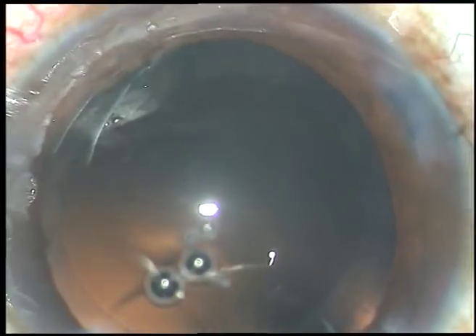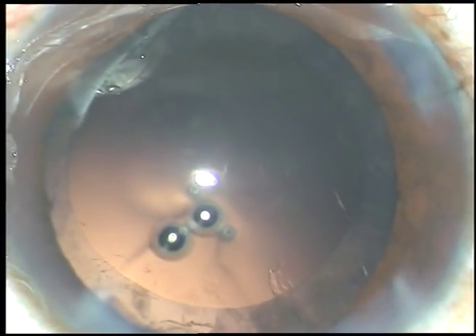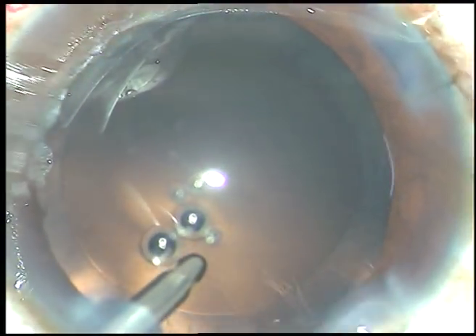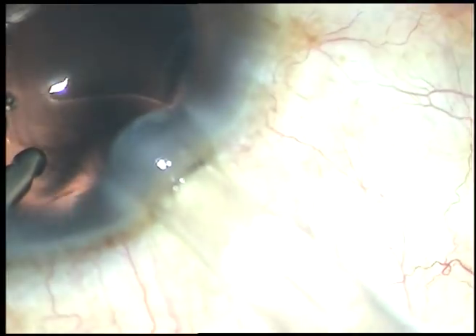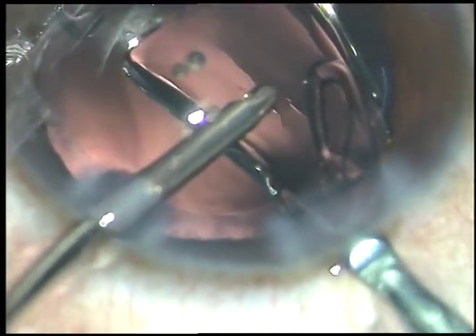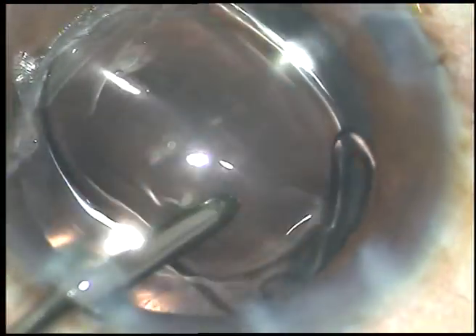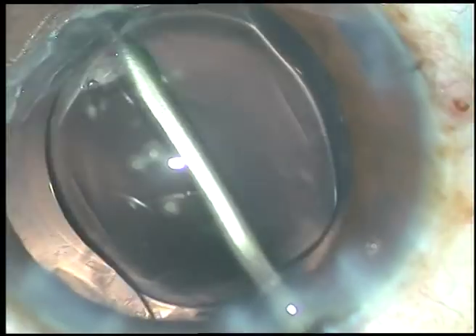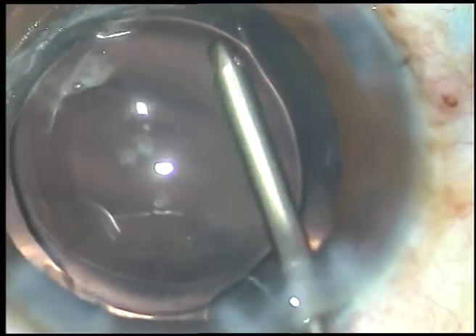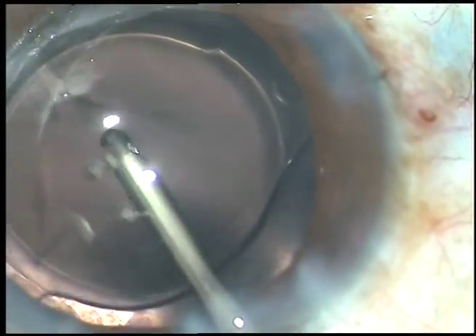In this case, we have selected a hydrophilic acrylic intraocular lens, and it is being implanted keeping the anterior chamber formed under irrigation. The irrigating probe supports the anterior surface of the optic of the intraocular lens and places the haptics in the equatorial region of the capsular bag.